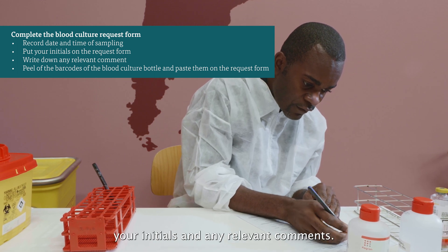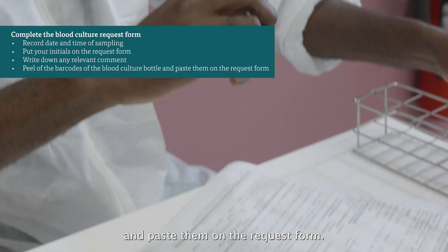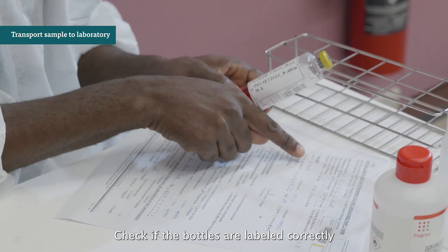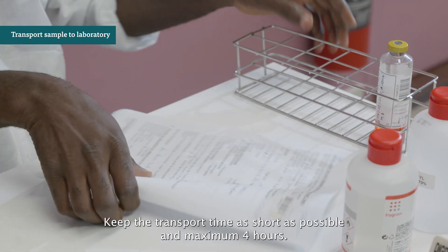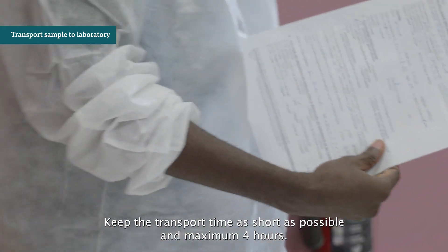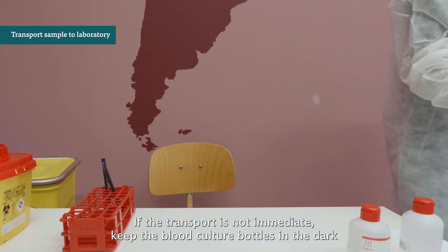Complete the blood culture request form with the date and time of sampling, the type of bottles, your initials, and any relevant comments. Peel off the barcodes of the blood culture bottles and paste them on the request form. Check if the bottles are labeled correctly and transport the bottles immediately to the laboratory. Keep the transport time as short as possible and a maximum of 4 hours. If transport is not immediate, keep the blood culture bottles in the dark and at room temperature, and never store them in the fridge.